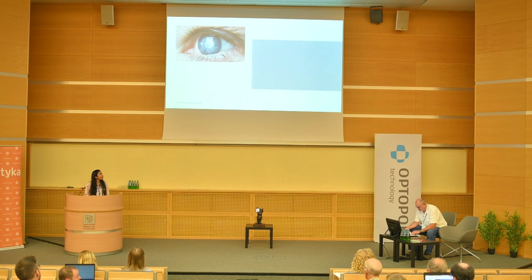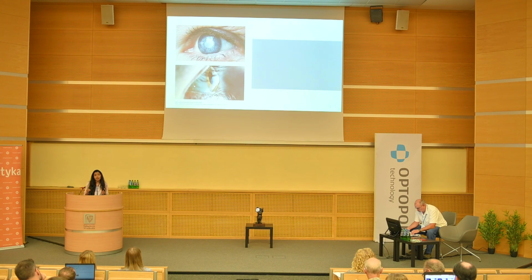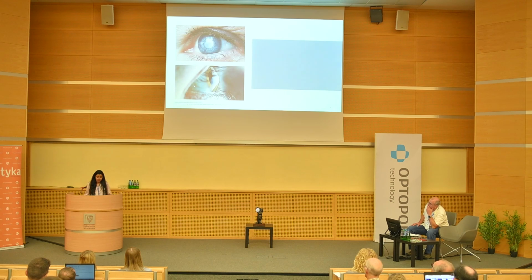In this process, there's a biometric scan and manual calculation, and then an IOL is chosen. Now, what if a patient who needs an IOL surgery also has another condition called keratoconus? Keratoconus is a condition where the cornea progressively gets protruded, and as you can see in the figure, the corneal curvature changes with the protrusion. As a result, there will be a lot of aberrations in the eye, like coma, astigmatism, and several higher-order aberrations. This really complicates the situation, especially when it comes to IOL corrections.